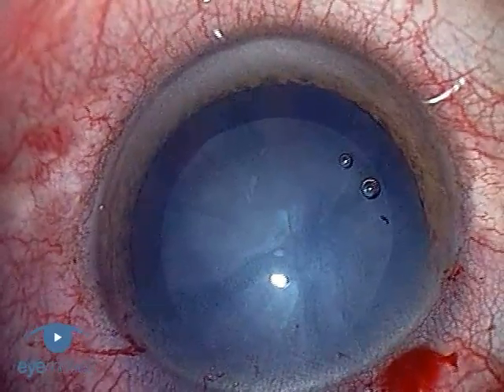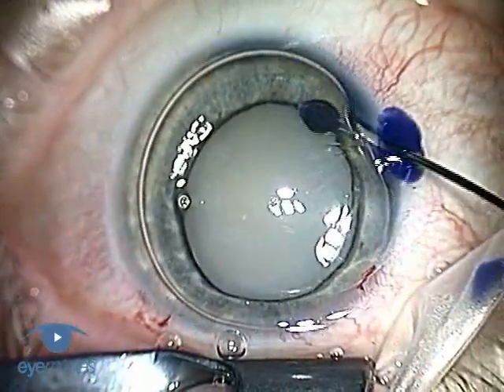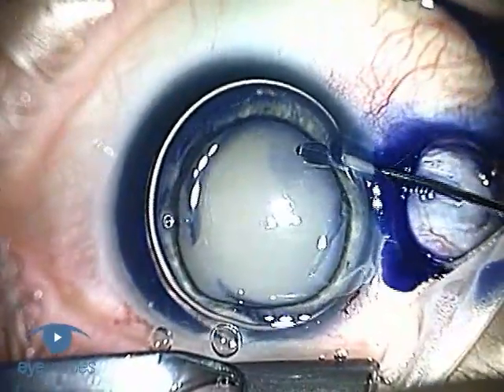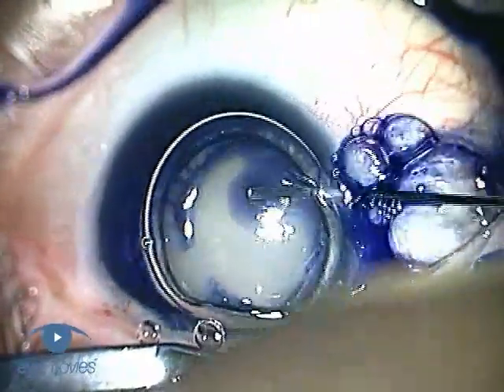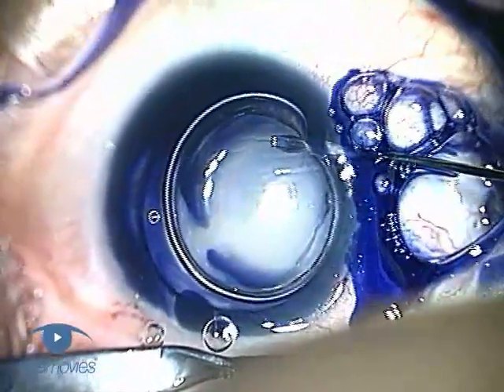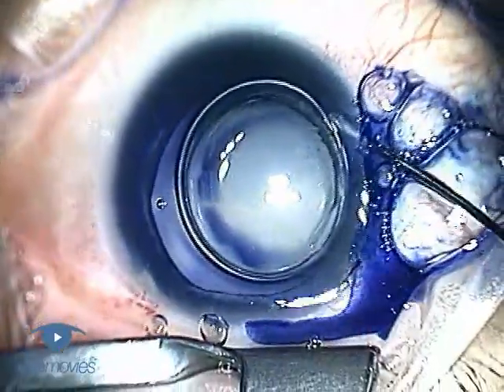The original technique described using air to fill the anterior chamber before injecting the dye. This worked okay, but it could be fairly messy with a lot of excess dye washing around, and also it was more difficult to control the chamber when it was full of air rather than viscoelastic. A few modifications have since been made, and many surgeons now prefer the following method.